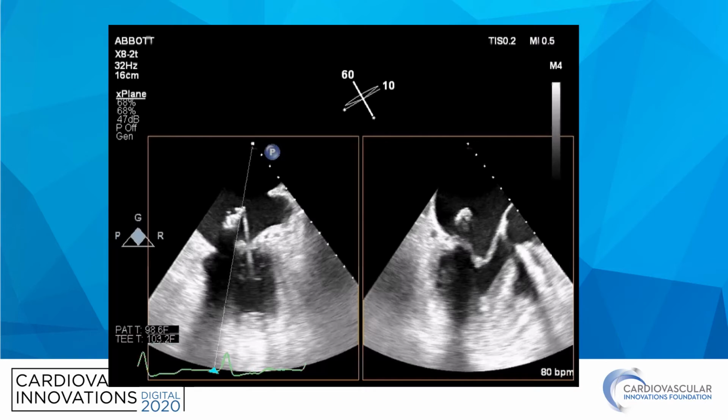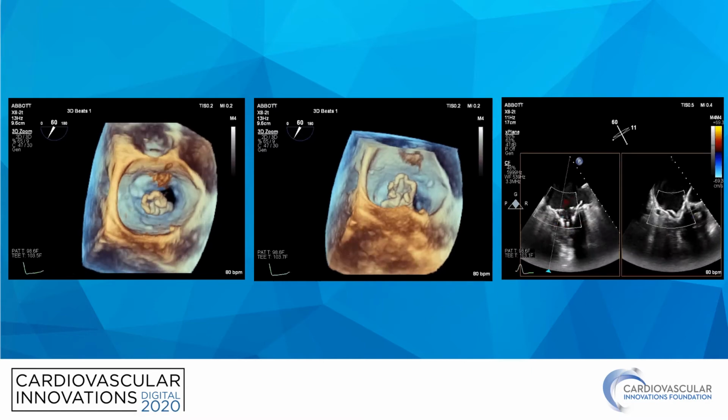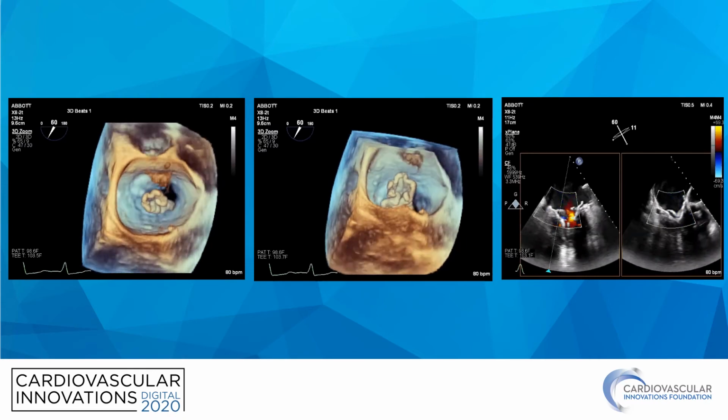And we see here on the left the medial to lateral direction of the valve after it's been inserted through the transapical access. On the right side is the anterior posterior trajectory of the same valve after it's inserted. After the valve is inserted, further deployment is guided by 3D echocardiogram, and we see that the A2 portion of the Tendyne valve is pointed towards the commissure, and therefore the whole valve system is rotated such that the A2 portion is pointing towards the A2 portion of the mitral valve, i.e. towards the aortic valve in the surgeon's view.